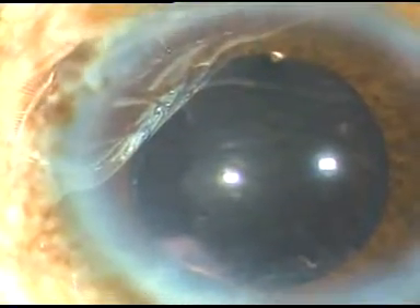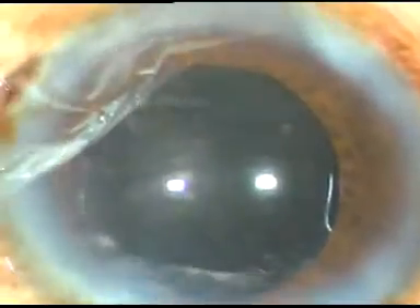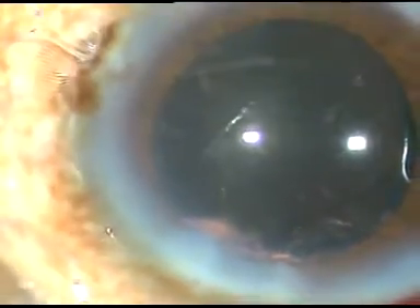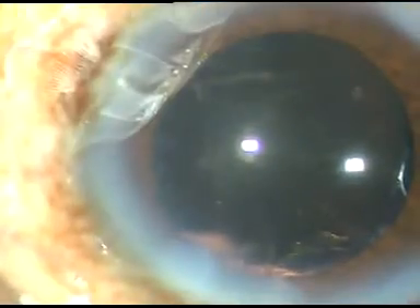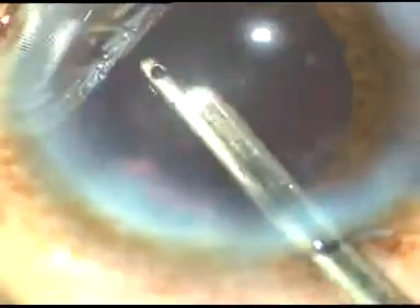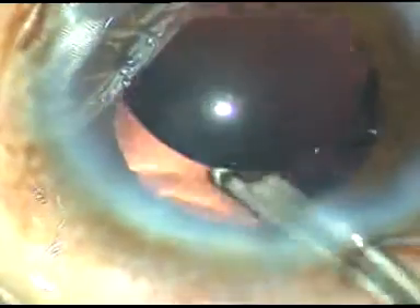That's it — the case is nicely done. Now the side ports are hydrated to make these wounds waterproof. The stab incisions are hydrated by stromal hydration. This is the final lavage of the anterior chamber. The anterior chamber is formed nicely and the case is concluded.